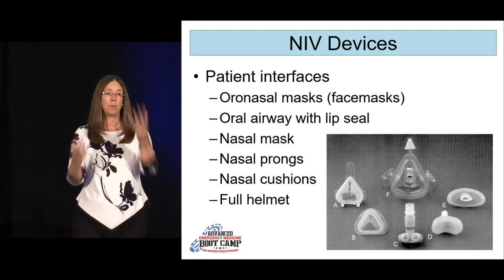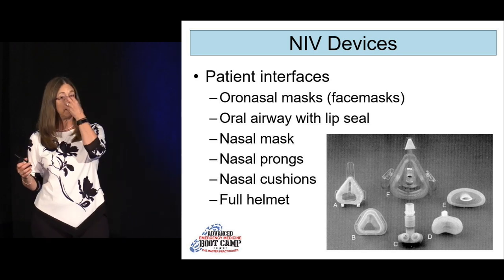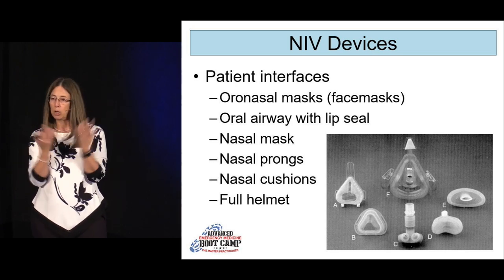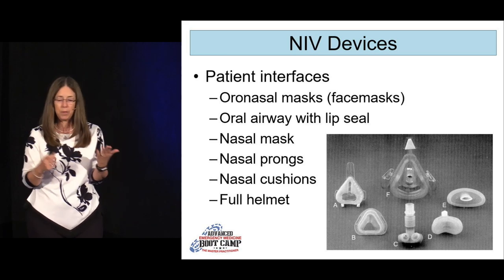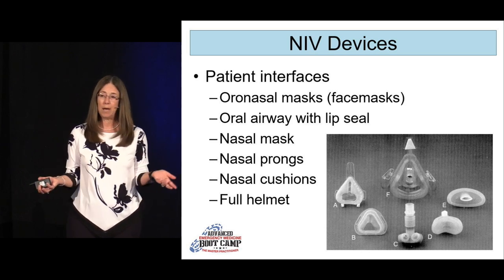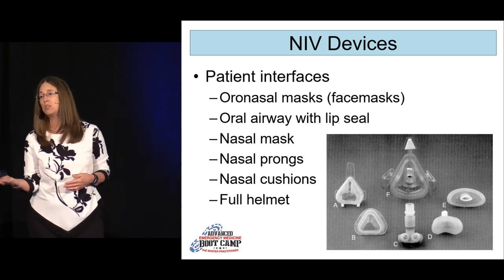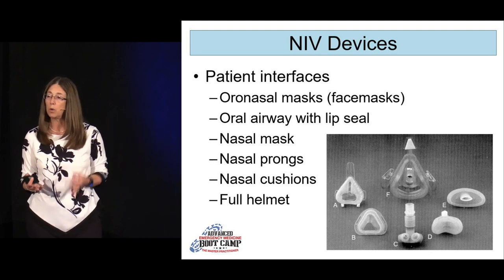It needs to be a system where the pressure is controlled and all enclosed. It's one of the reasons if you use just the nasal anything, just a nasal mask or a nasal cushion, if the patient's mouth is open, that system is no longer a closed system. That's why these people need to keep their mouths closed, or there's sometimes a chin strap to help with that. I'll tell you, when it comes to these interfaces, if you look at the literature that's out there, there's not one that's particularly better than another, which is great. So what that tells you is that you can work with the patient individually, or you and your RT can work with the patient individually to choose which one works best for them.